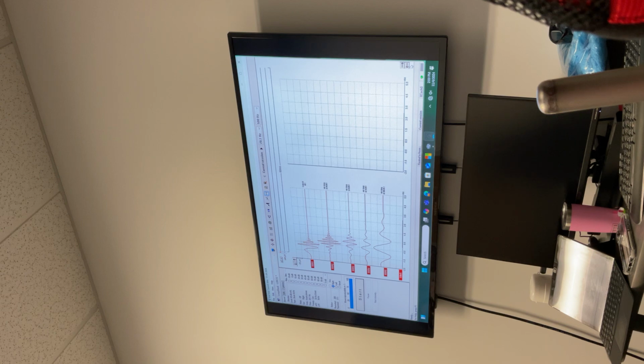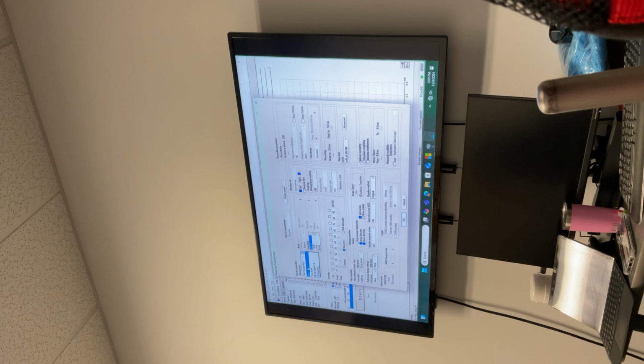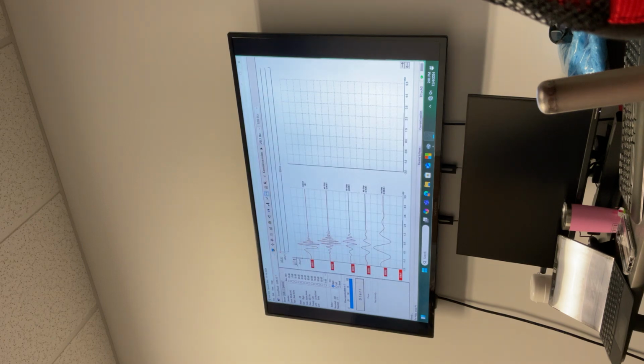The top one is a broadband chirp. It's not click though. You want to see the click? Let's play the click. The top one is the CE chirp. This is 4000, 2000, 1000, 500 narrowband CE chirp.